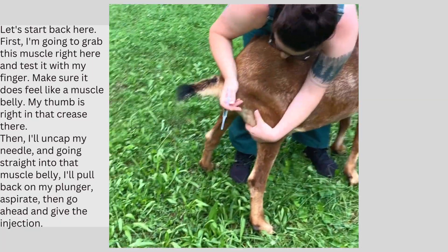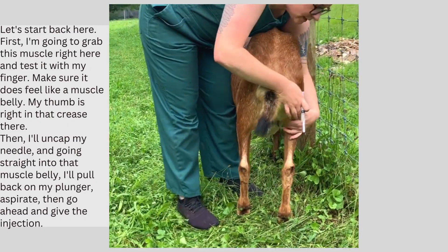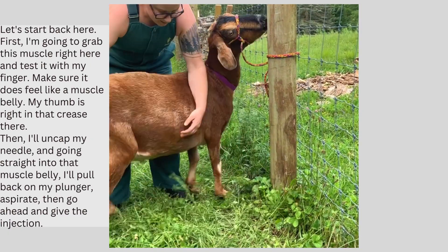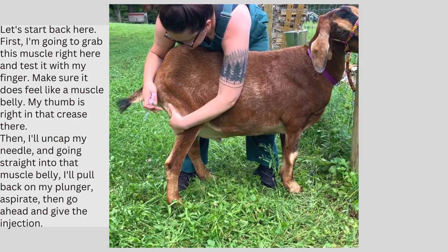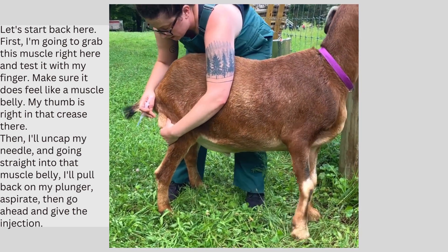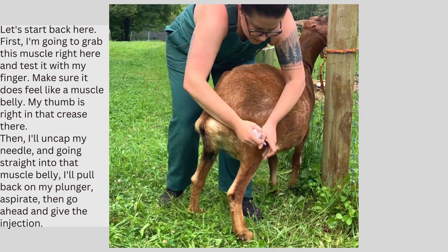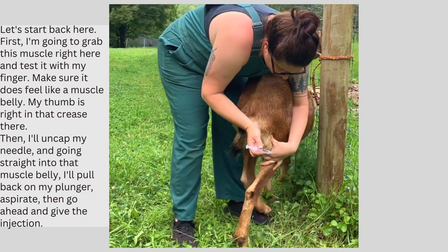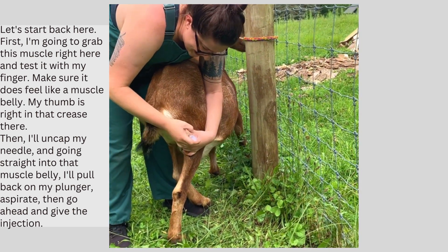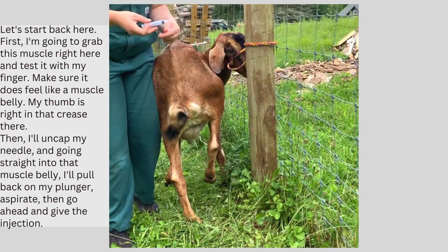Alright, first what I'm going to do is grab this muscle right here and test it with my finger, just to make sure that does feel like muscle belly. My thumb is right in that crease there. Then I'm going to uncap my needle, going straight into that muscle belly like this. I'm going to pull back on my plunger, aspirate, and go ahead and give the injection.